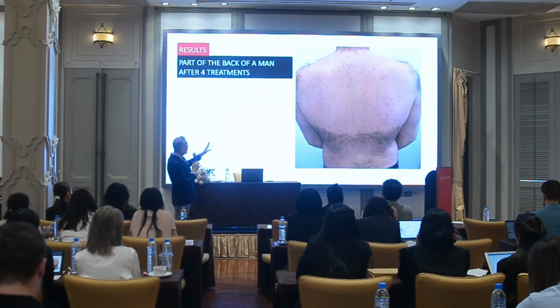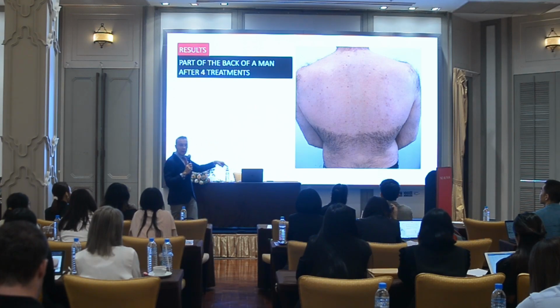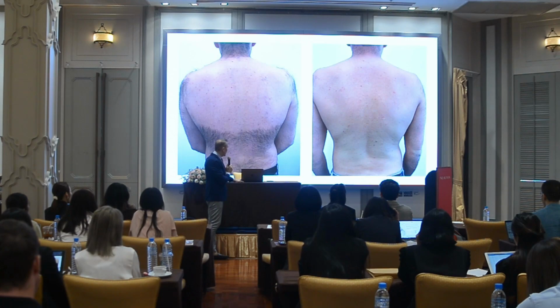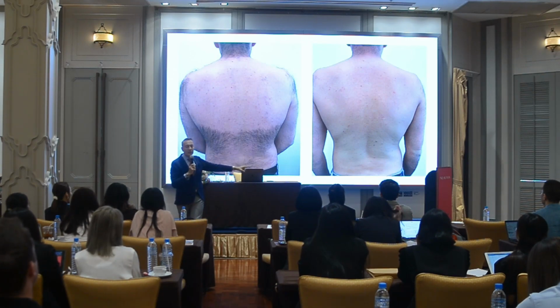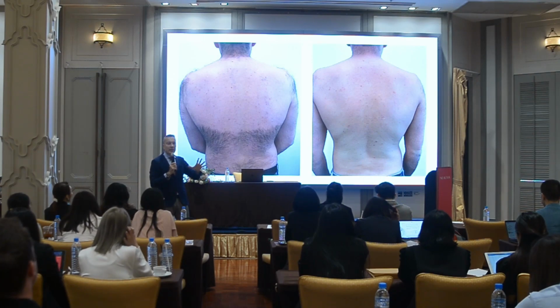So on top you see the back after 4 treatments with the stamp mode. And then we treated the lower back with the paint mode. I don't remember if I have here the picture. Yes, paint mode after 4 sessions. So exactly the same results.